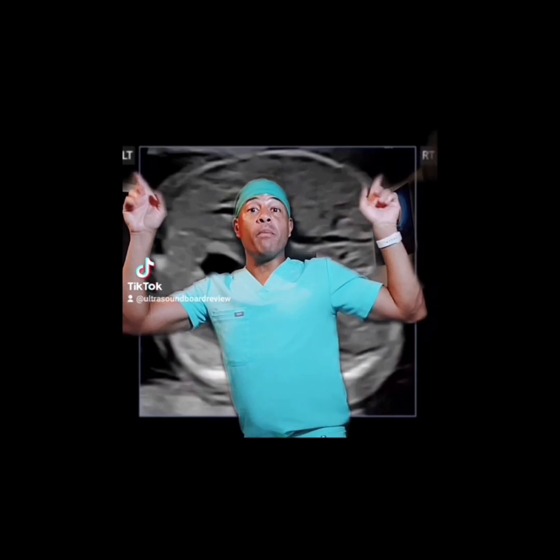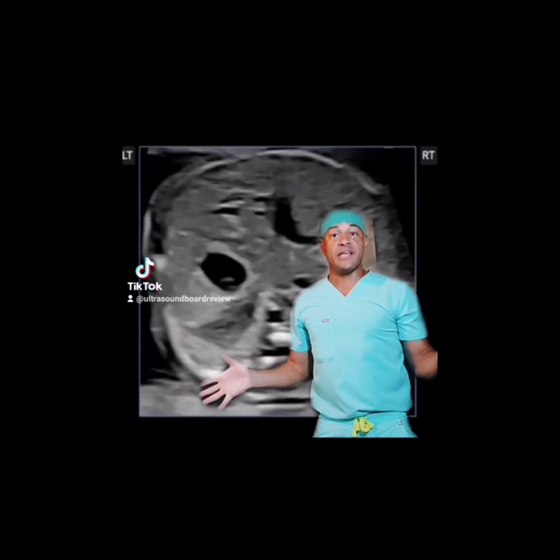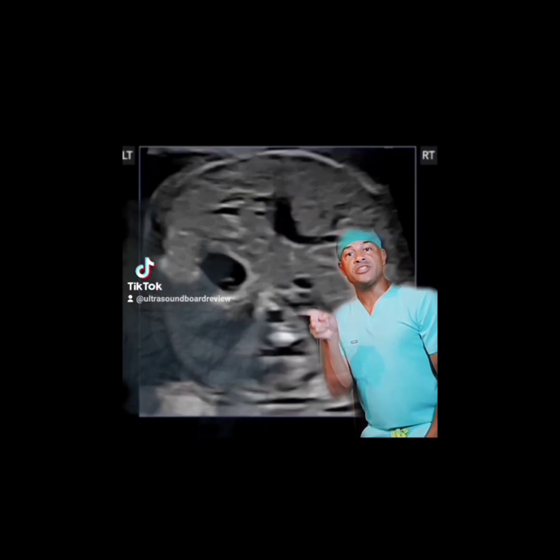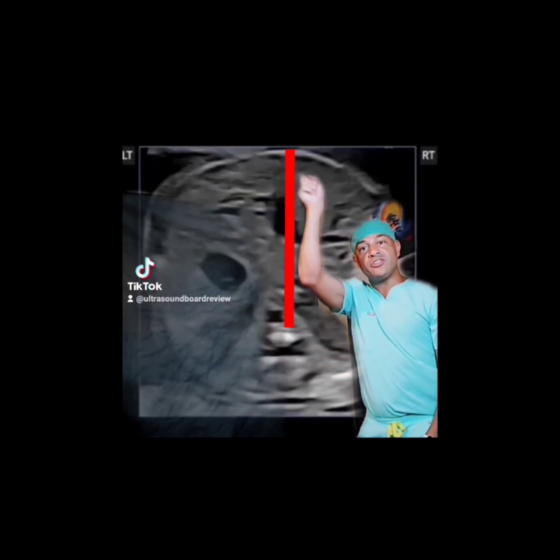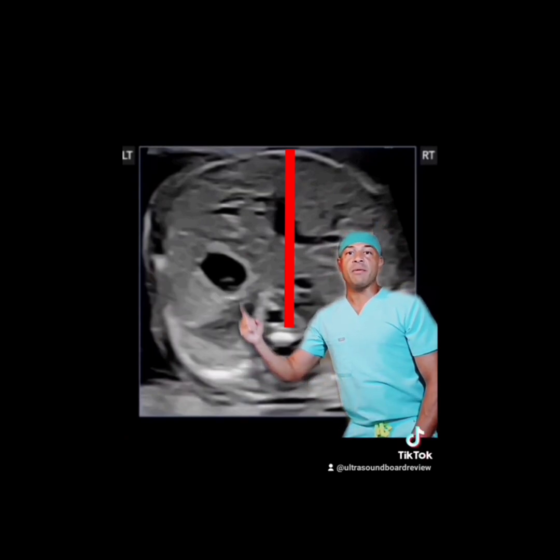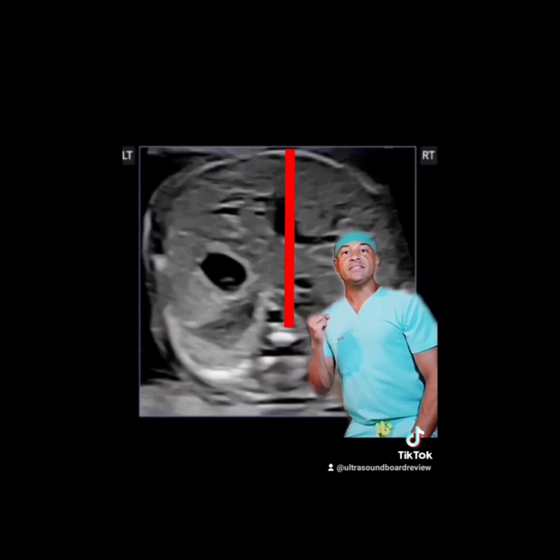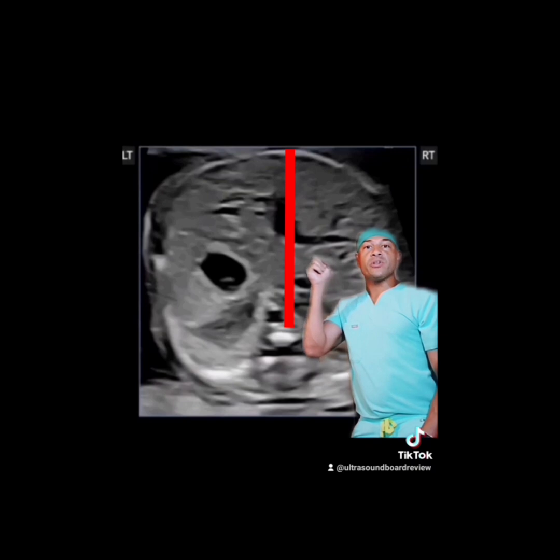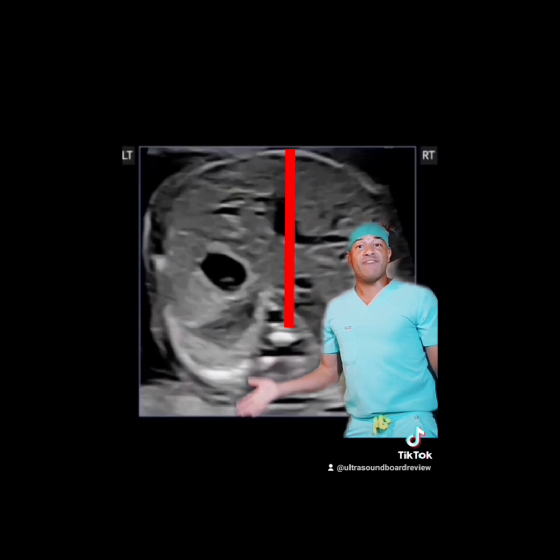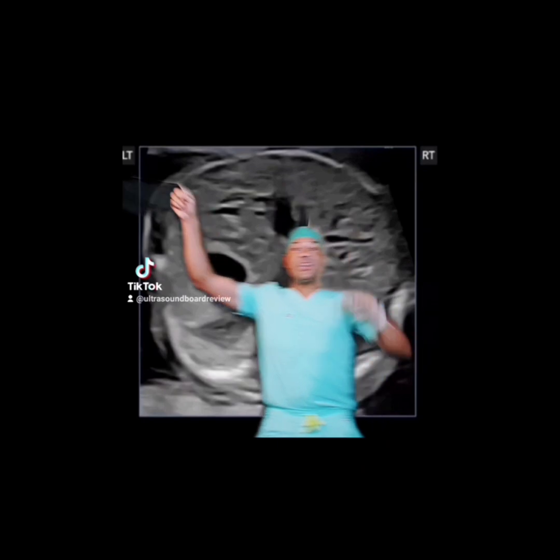If you have left or right markers on your image, you can orient the anatomy to help determine fetal presentation. With the spine at six o'clock, draw an imaginary line from the posterior to the anterior portion of the baby — this divides the left and right sides. Looking at the anatomy, we have the stomach on the left side, the aorta posterior to the left, the IVC anterior to the right, and the portal sinus L-shaped to the right. The only presentation we can determine from this is the cephalic presentation.